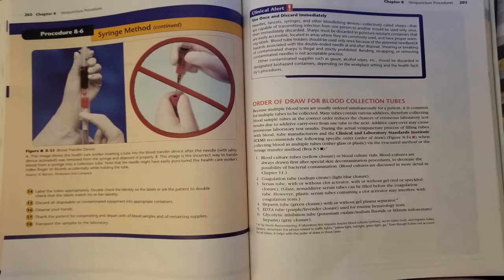During the actual venipuncture process of filling tubes with blood, tube manufacturers and the Clinical and Laboratory Standards Institute, or CLSI, recommend the following specific order of draw when collecting blood in multiple tubes, either glass or plastic, via the evacuated method or the syringe transfer method. Number 1, blood culture tubes or blood culture vials. Blood cultures are always drawn first after special skin decontamination procedures to decrease the possibility of bacterial contamination.